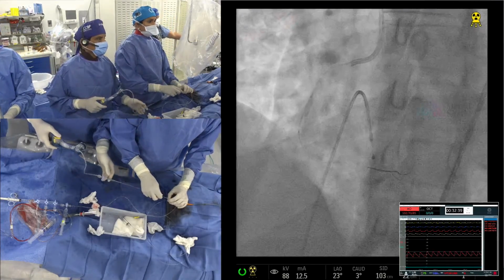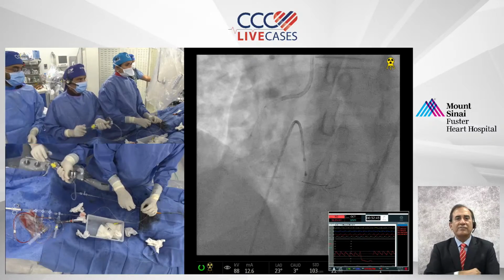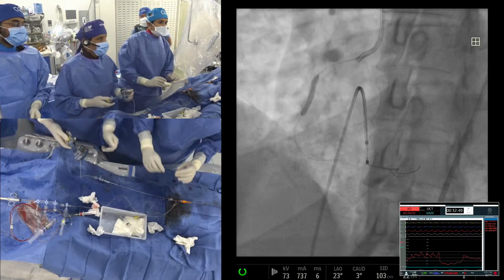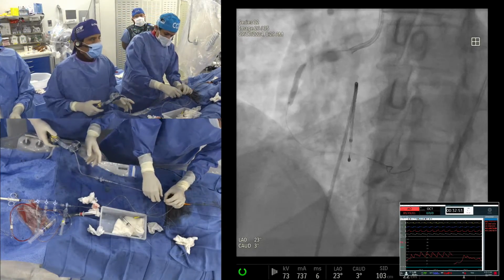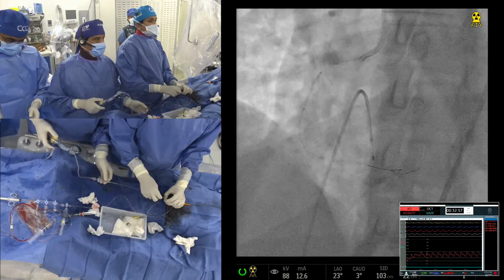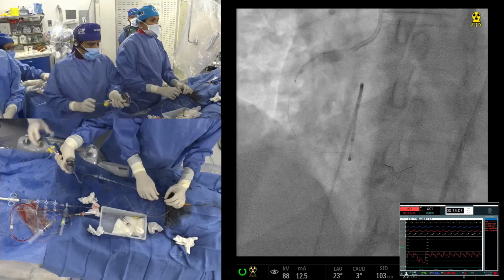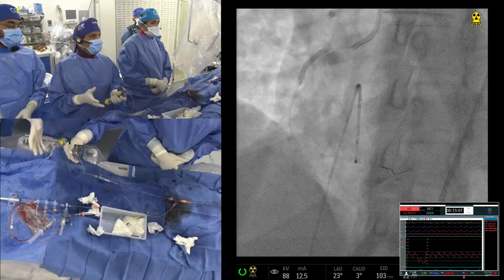A question here: what's your view on two-speed rota, the Japanese concept? They're saying that maybe you do a rota with a low speed, like 100,000 RPM, and you get a little better lumen. But I think 150 is good enough. 150 is the one which we do. It's quite good.